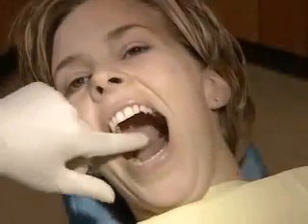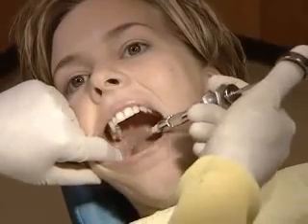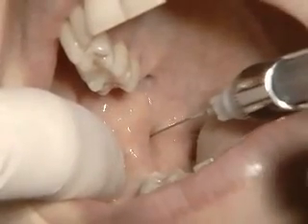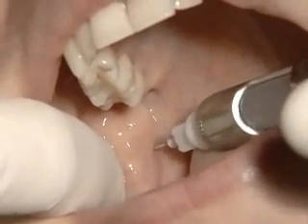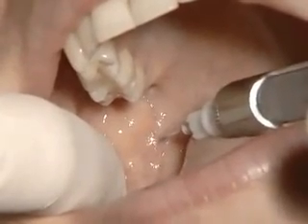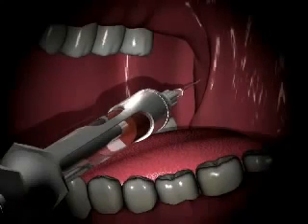After palpating the landmarks, you will be inserting the needle into the pterygotemporal depression. The needle is brought in from the contralateral side, and insertion point is directly there, and advance slowly until you go 25 millimeters. Once bone is hit, you withdraw slightly, you aspirate, and slowly begin to inject a full cartridge of local anesthetic unless you are following with a buccal nerve block, in which case you should inject 3/4 of the cartridge.